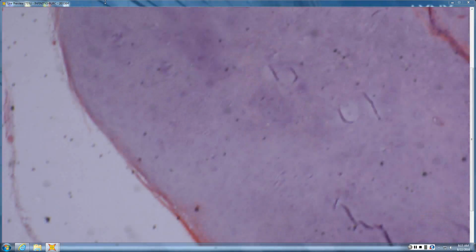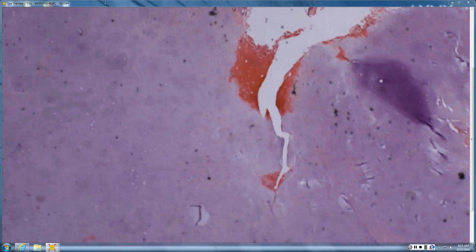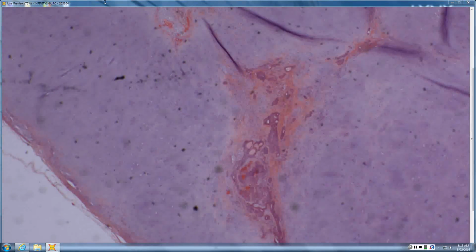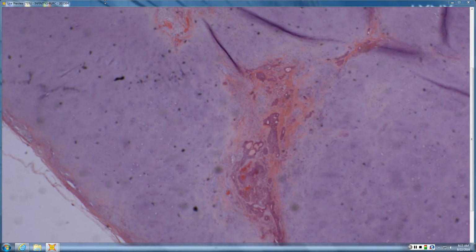Okay, Katie, what do you see? Very chondroid. Yeah, so you've got what looks like a chondroma, right? But you have one tiny little area of duct. So it makes it mixed. We had one fellow who liked to call this a chondroid syringoma. Big chondroid and a little syringomatous element in it. It's just a mixed tumor, and you can have any proportion of the mesenchymal and the glandular elements. So this is big chondroid, little syringoma.